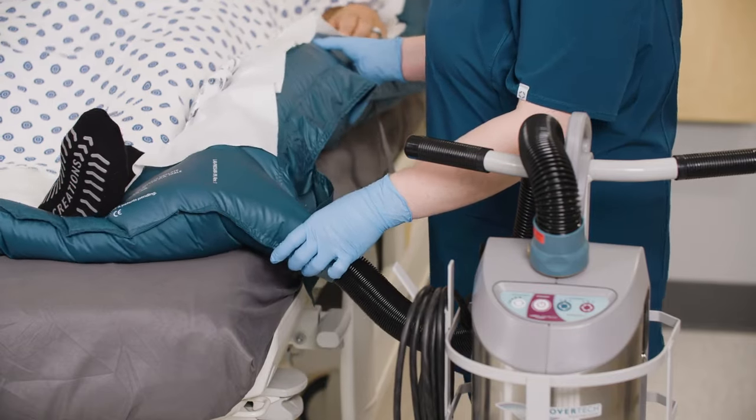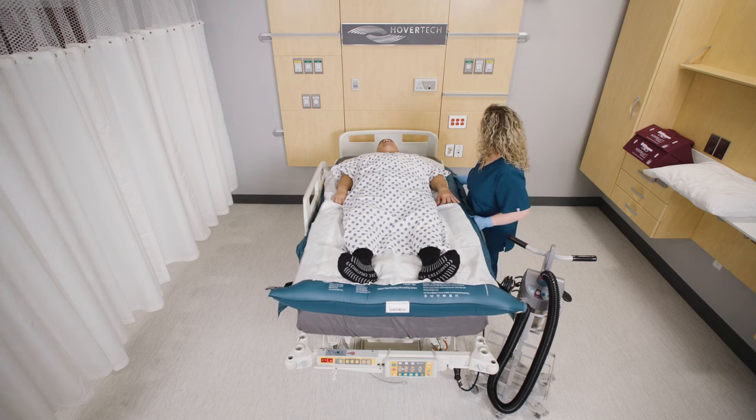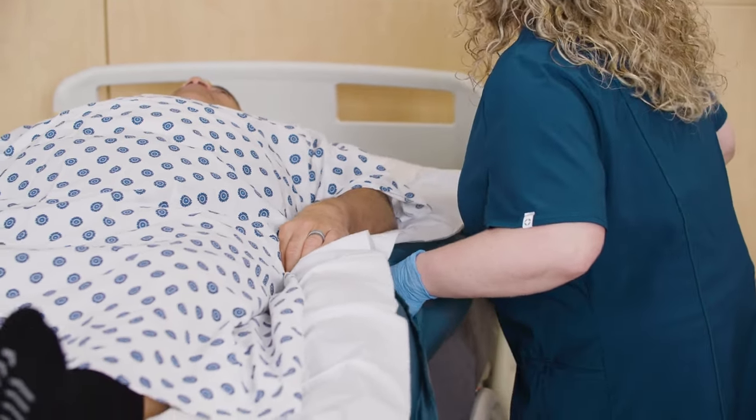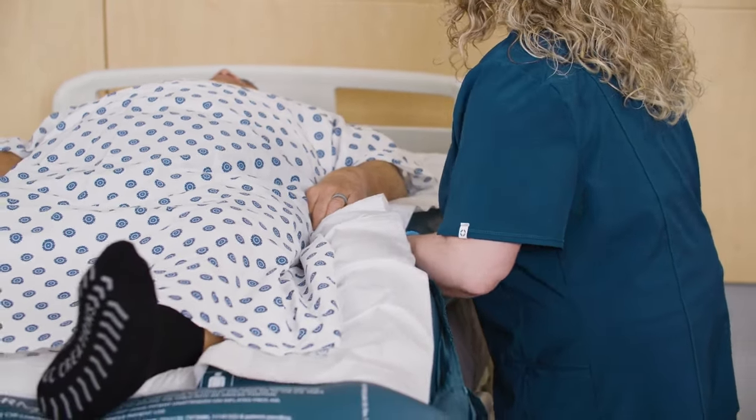The HoverTech Air Supply inflates the Pro's AIR to cushion and cradle the patient, while air simultaneously escapes from the holes on the underside, reducing the force needed to move the patient by 80 to 90%.